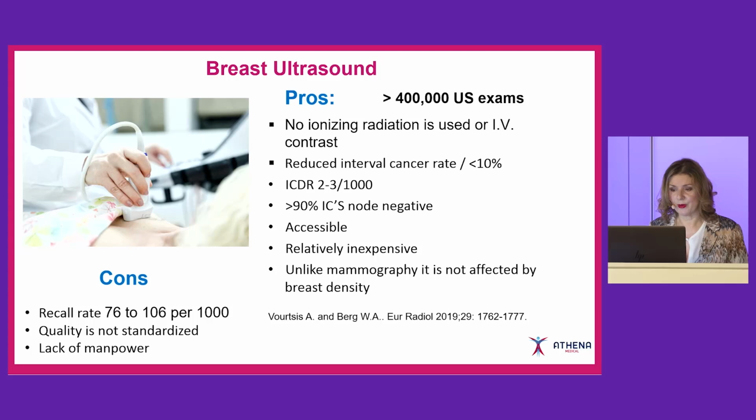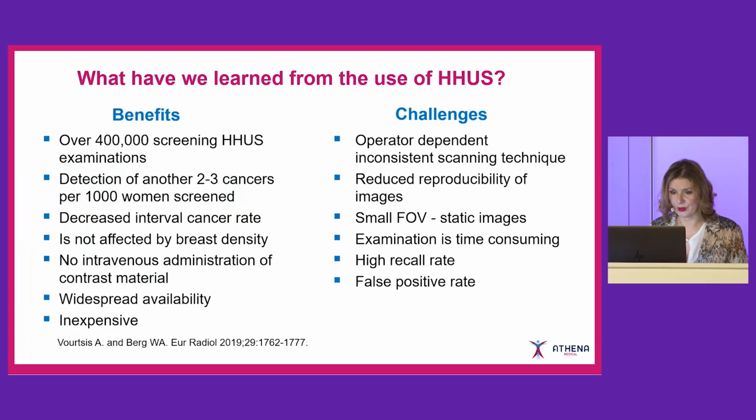We always perform breast ultrasound in women that have ACR C and D breast parenchyma. So it is a very accessible technique. Studies have shown that there is an incremental breast cancer detection of about 3 cancers in 1,000 women screened. Most of these cancers are node negative, which is important, and are invasive carcinomas. Unlike mammography, ultrasound is not really affected by breast density. And we evaluated, in this study with Dr. Wendy Berg published in European Radiology, more than 400,000 ultrasound examinations.